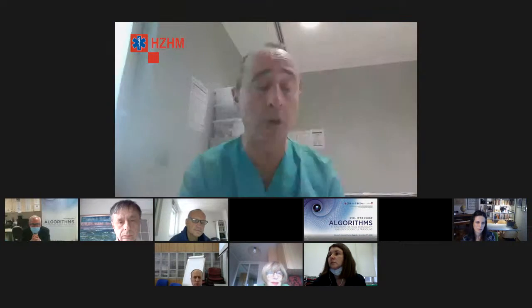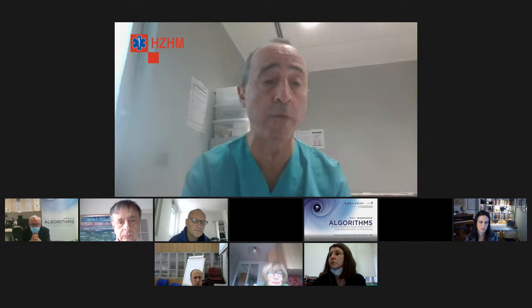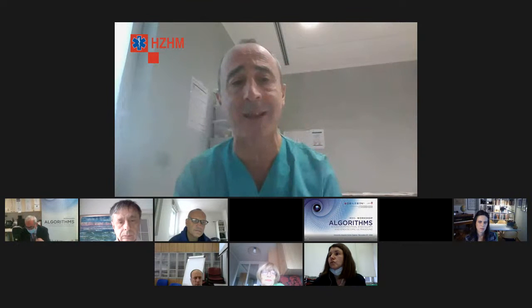One short question: the avoidance of anticoagulant therapies, perhaps like in other invasive endoscopic gastroenterological procedures, I suppose. Did you hear, Ale, the question? Oh, yes, you're right. So we have more and more patients on anticoagulants, especially with the Zenker.